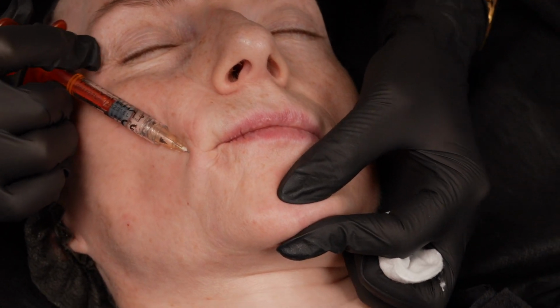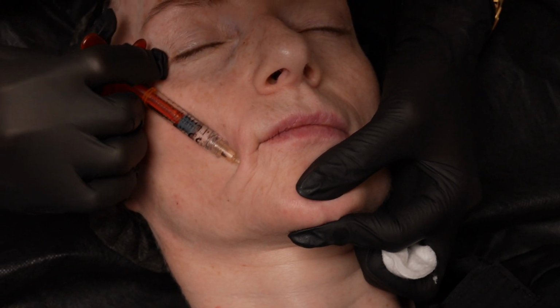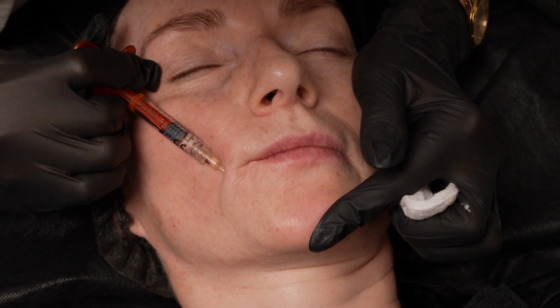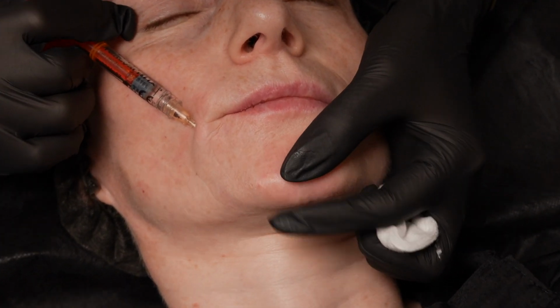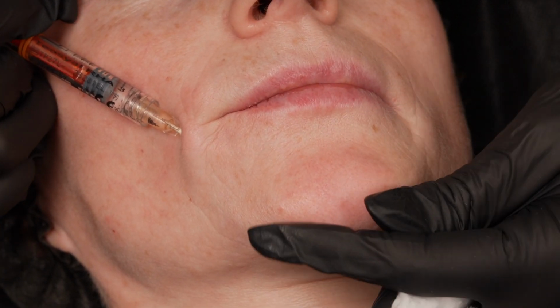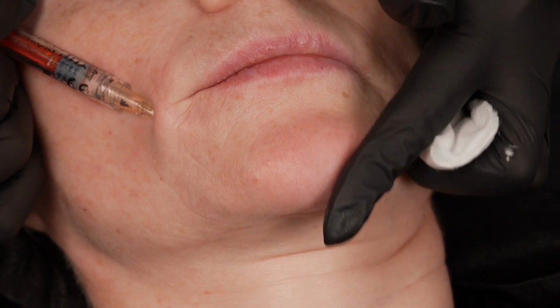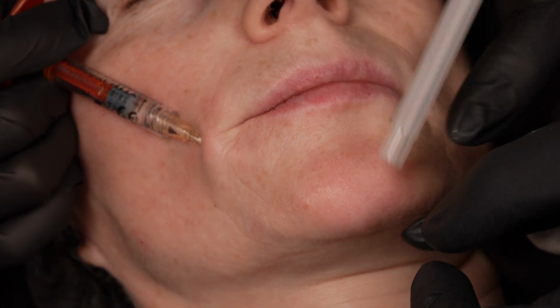If you inject deep here, you can just project the chin. You cannot correct this shape. Exactly. The shape corrections, you need superficial injections. And this area, superficial injections, it's better to do with cannula. Superficial with needle is quite dangerous in the tip of the chin, okay? Perfect. Just a little bit here.